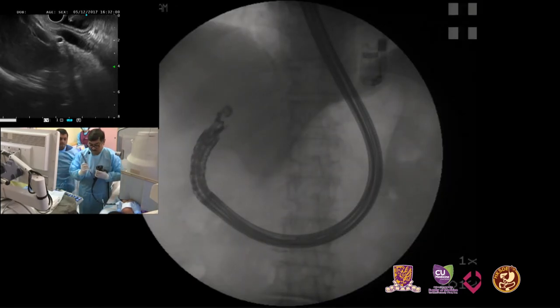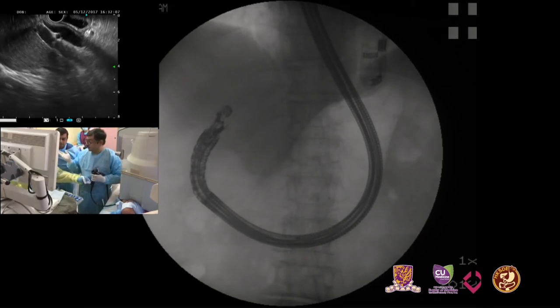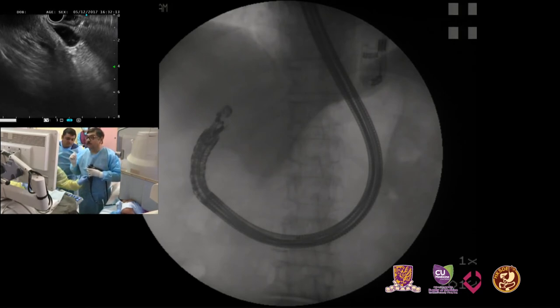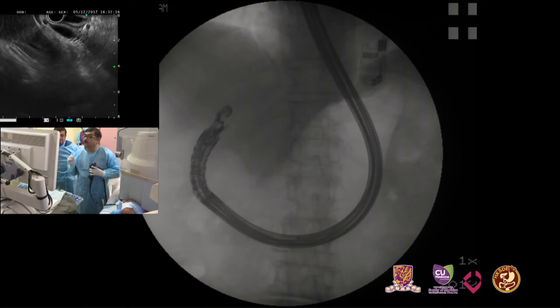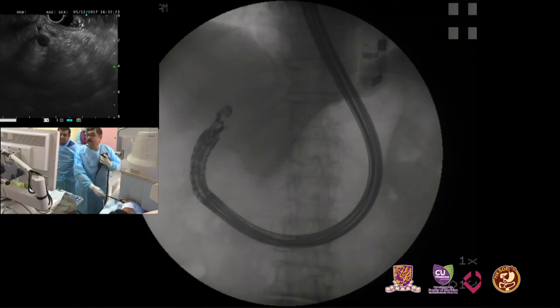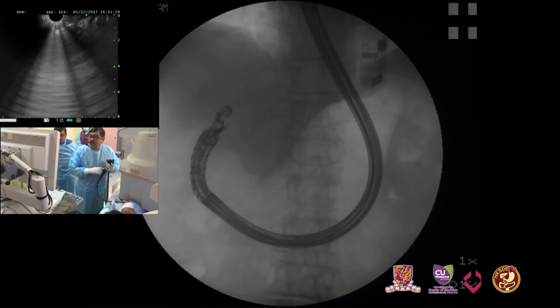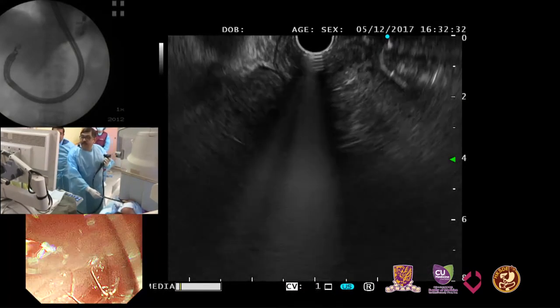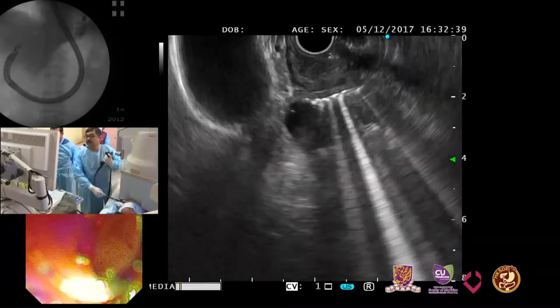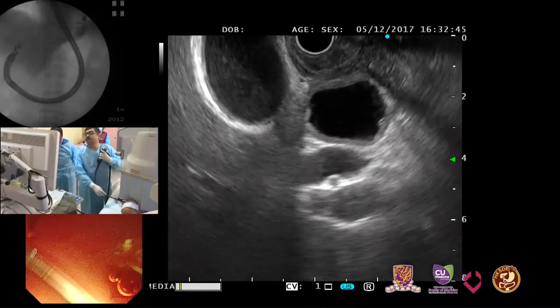The other tip is you should have nice assistants to help you, like I have wonderful assistants right now with me. And the third thing is, once the wire is out of the papilla, to grab it and pull it back into the scope, the wire sometimes slips. So don't worry, it's not a major problem. You will always manage it, almost always, without any problem. I try to cannulate for about 5 minutes by the side of the wire. And that succeeds in about 65 to 70% of cases. If it doesn't succeed, then I do the classical rendezvous.